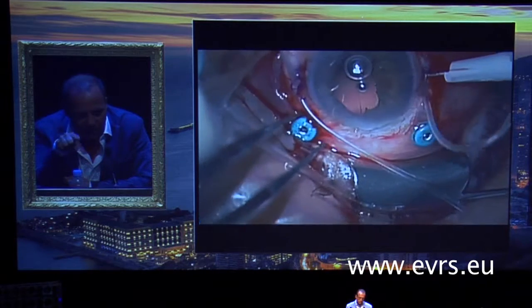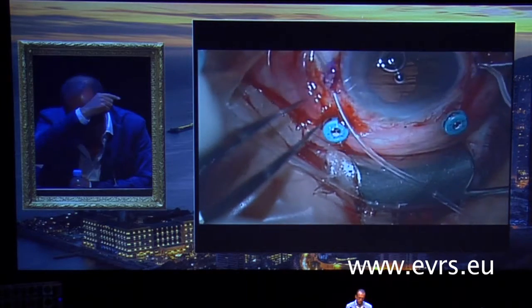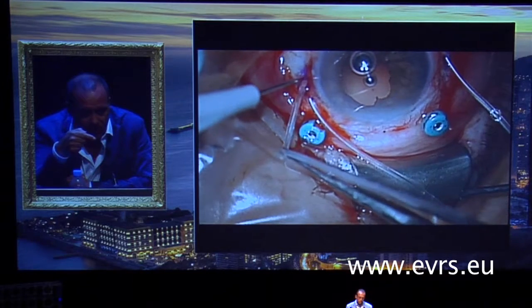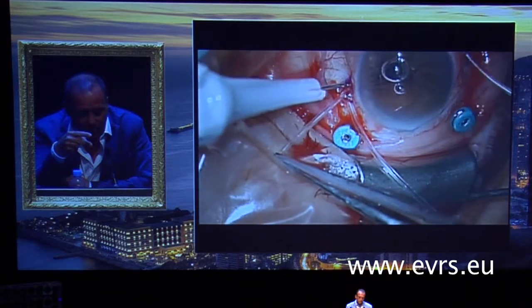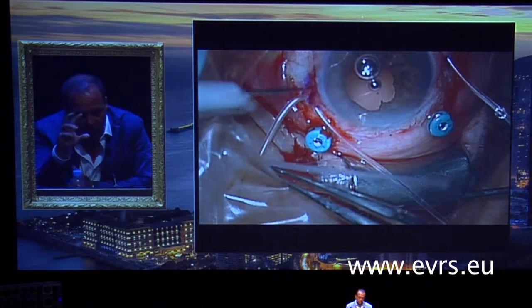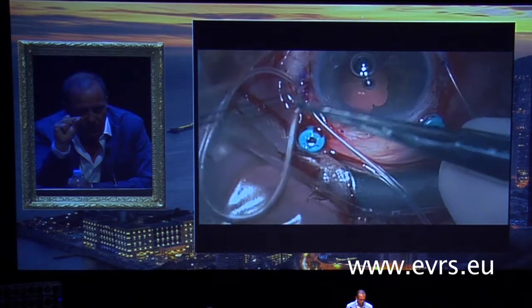So I pass the two tubes into the sclera first, then with the trocar, I make a hole in the sclera. This is the first time that I try this, and it's not so difficult, really. It's a little bit long, but not difficult. Then I pass the tube into the sclera with the forceps.